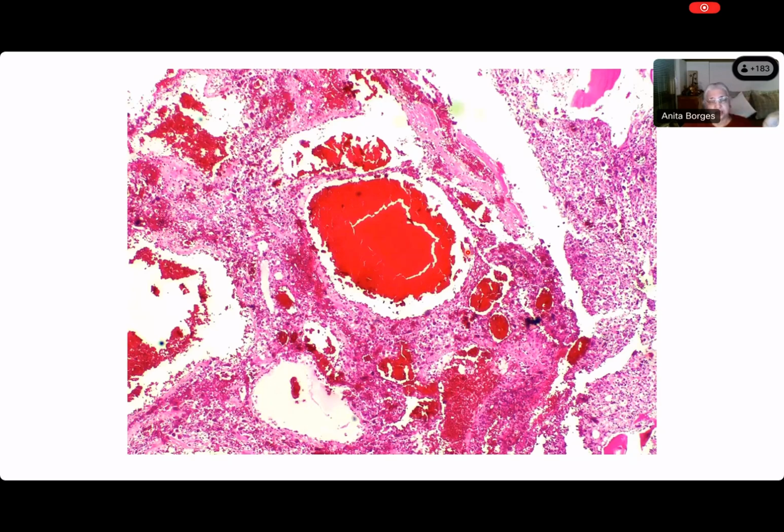Would you call this hemorrhage? All right, now Sarangi thinks it's hemorrhage. Zara, what do you think? Hemorrhage or no hemorrhage? No, ma'am. So if it's not hemorrhage, what is it? Now you can't say no, ma'am, and not tell me if it's not hemorrhage, what is it? All right, while you're thinking, Hema, do you think it's hemorrhage or no hemorrhage? Ma'am, these are blood-filled spaces, grossly also in the tumor, ma'am.